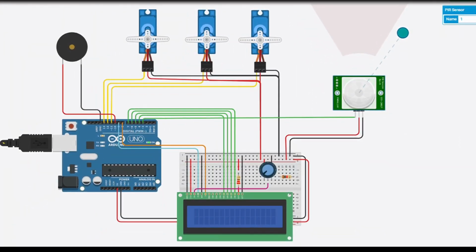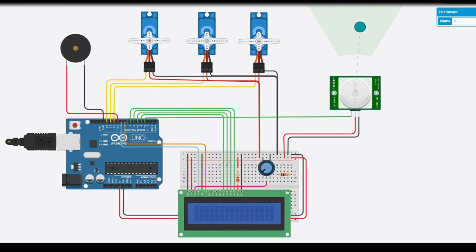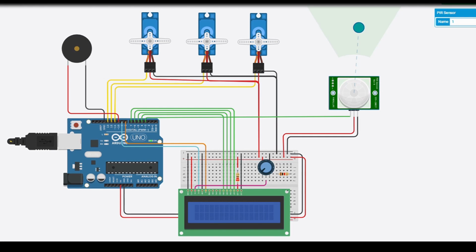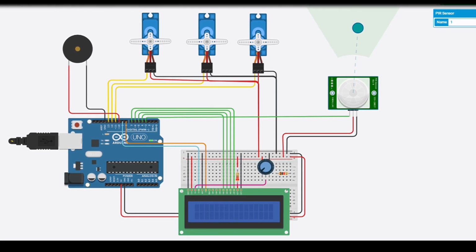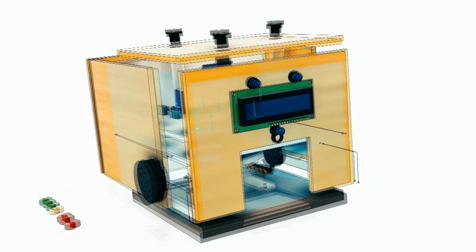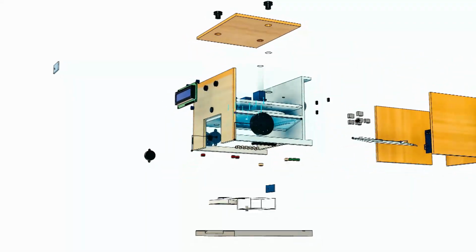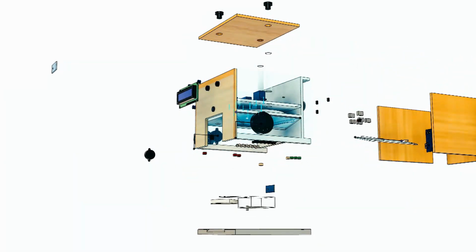Suppose the blue sphere is a tablet and it enters the dispenser cup. Even after the set duration, if the tablet isn't consumed, the machine will alert with the buzzer and flashing. We have reached the end of the simulation part. Summing it all up, we saw how we identified the problem, defined it, specified objectives, designed prototypes to achieve that, and at last, the visuals of the virtual demo.